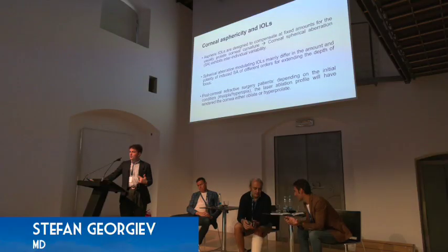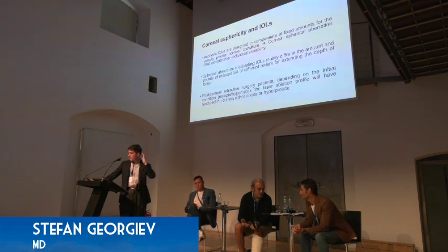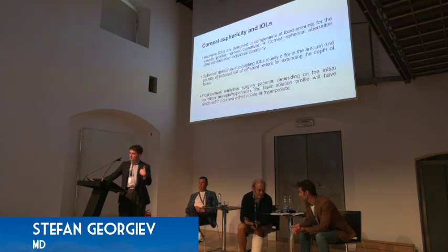There are also newer lenses nowadays. I mean, newer, they've been around for some time now, but they all essentially play with spherical aberration to induce depth of focus, with different orders of aberrations to enhance or alleviate presbyopia. And lastly, as previously mentioned, post-refractive surgery patients will have an altered cornea, which will obviously depend on the initial condition.